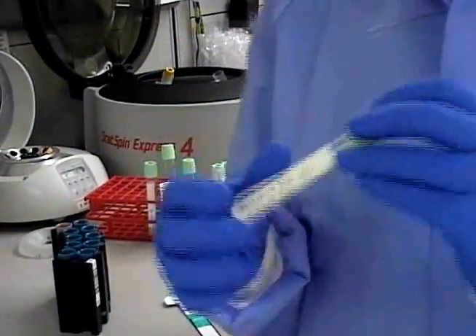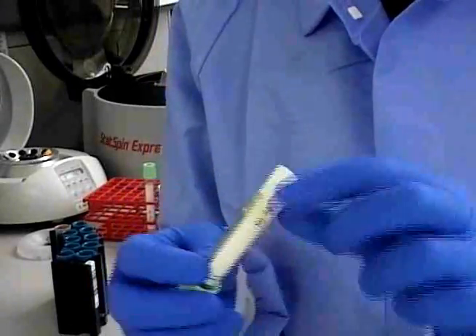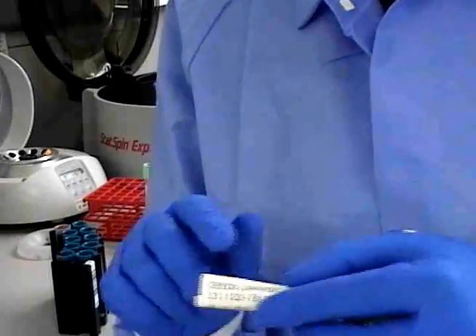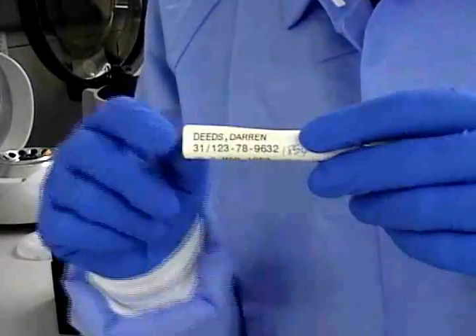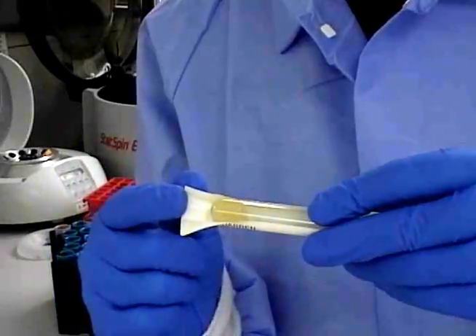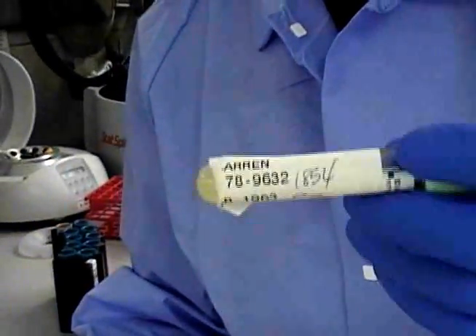And this one right here is one of my favorites. It's upside down, it's hanging off the end, which isn't a big problem, but look where the name is. This, since it's sticky, can get stuck in our instruments, cause us to jam up, and if we tear it off, there goes half the social and the name.